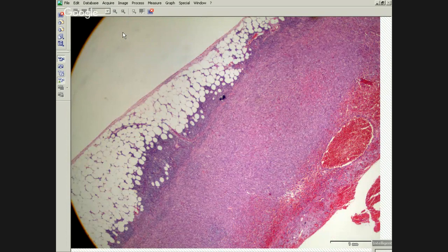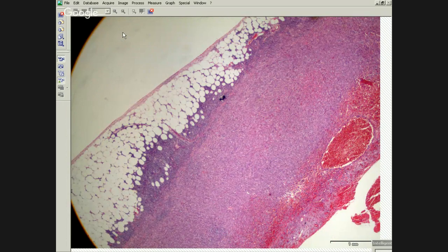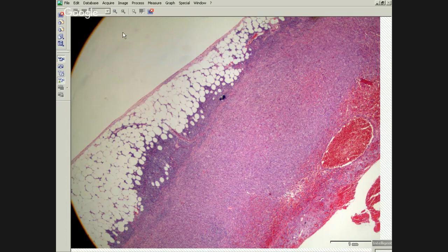You have exophytic papillary cores that are typically lined by a single layer of mesothelial cells, and they're not invasive, or maybe they'll have just what they call little seedling foci, but you don't have diffuse pleural thickening or diffuse disease throughout the abdomen typically with that. That's a completely different entity. But that does bring up an issue about grading with mesothelioma. They all typically behave very aggressively in spite of the fact that they don't look cytologically that bad most of the time.